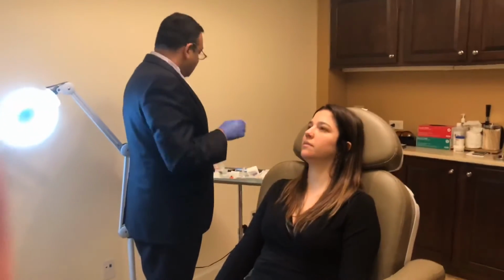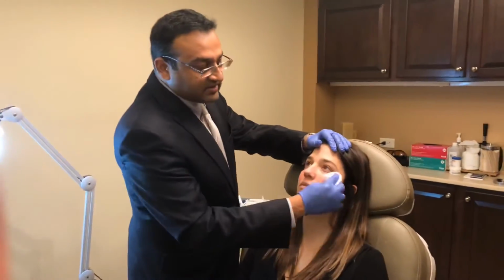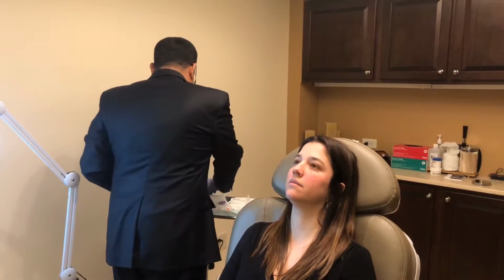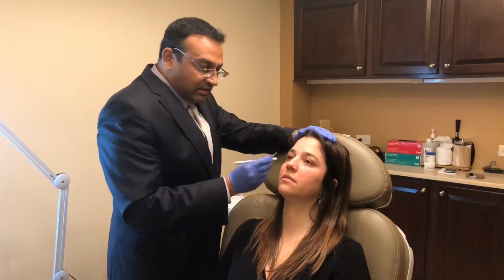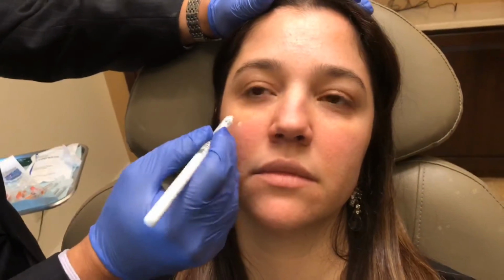So before we get started, the first thing we're going to do is just clean the area on both sides. This is just to disinfect the skin and try to make the procedure as sterile as possible. And again, with the cannula technique, unlike using the needles, we're not making more than one poke really. So if I want to fill this area in right over here, I'm actually just going to come from around here and I can fill this part in and this part in just from this one point of insertion.